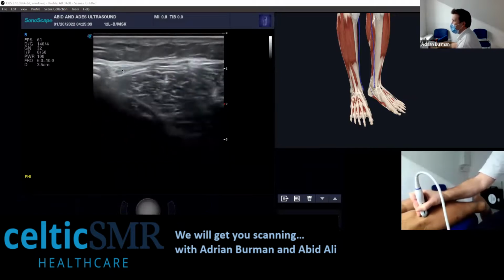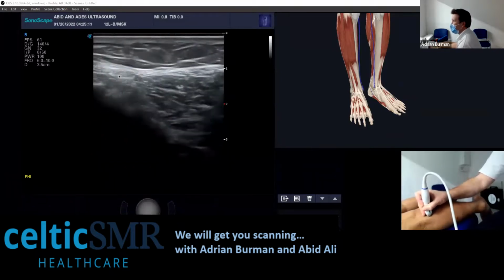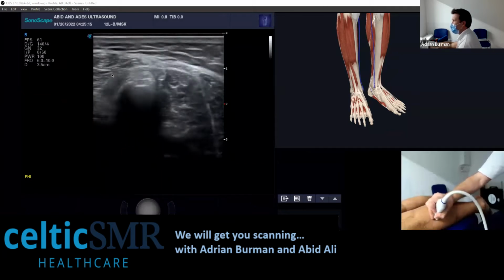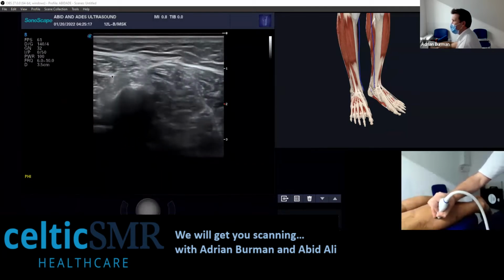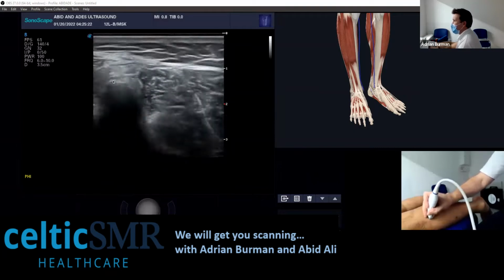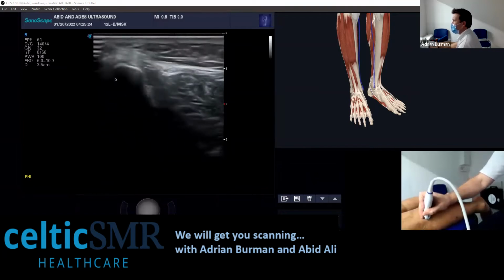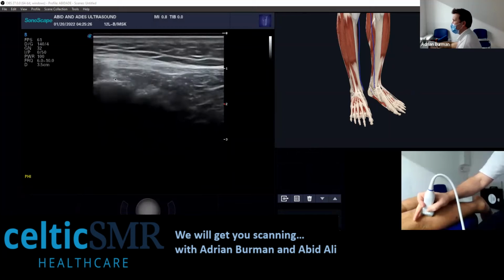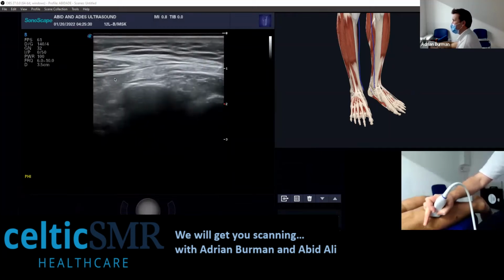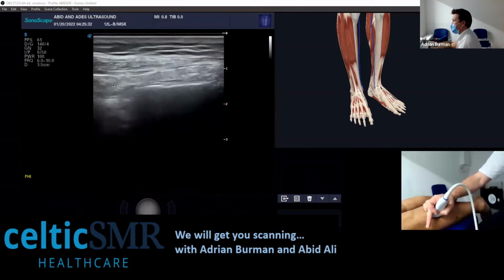And it goes. In long section, I tend to just see how the colour changes, and it'll be really thickened as it goes round.